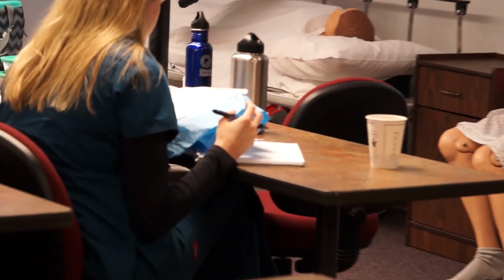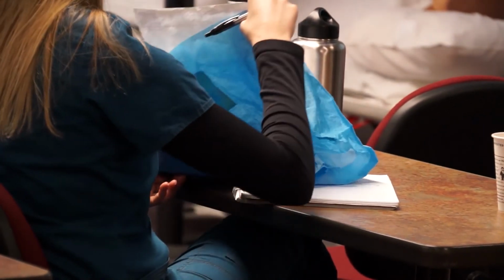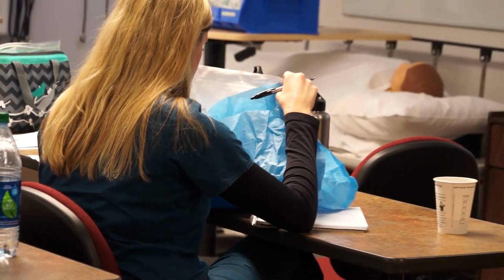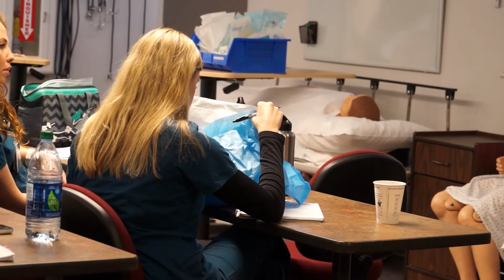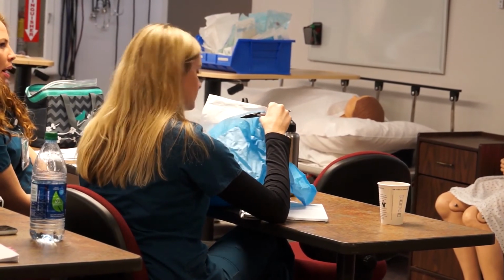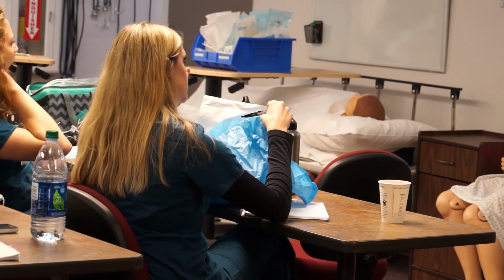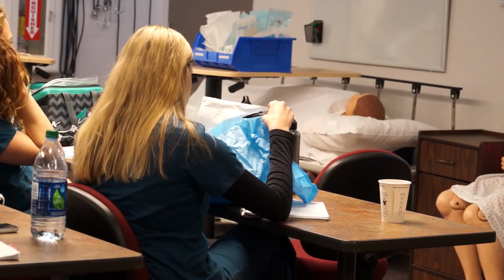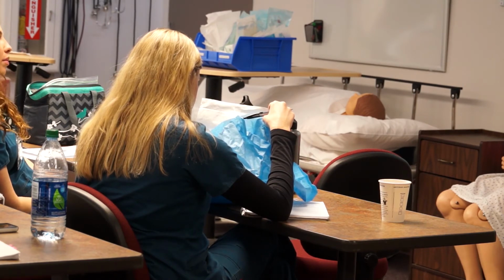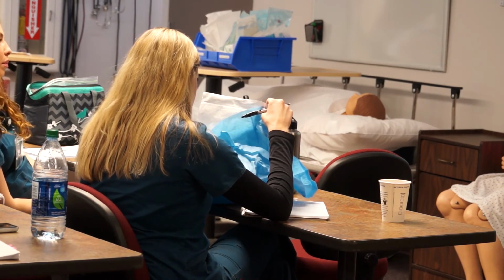A towel roll, sometimes they put a towel underneath the shoulder. If they're going to go in on this side, they'll put a towel underneath the shoulder to kind of bring that side up a little bit. It makes it a little bit easier access for the physician. And then you may need to put the patient in Trendelenburg. What is Trendelenburg? Head down. Head down, feet up. Yeah, so it's like this with their head down. And then you want to monitor your patient when these are being placed in. So usually you do Q5 vitals while they're being placed to make sure that they're okay.